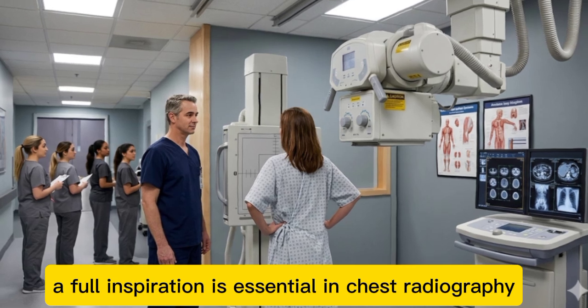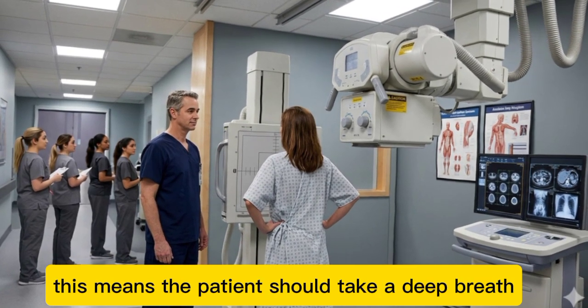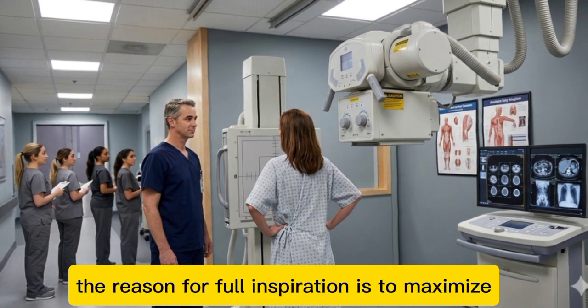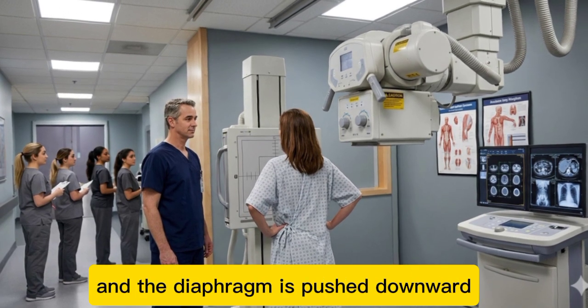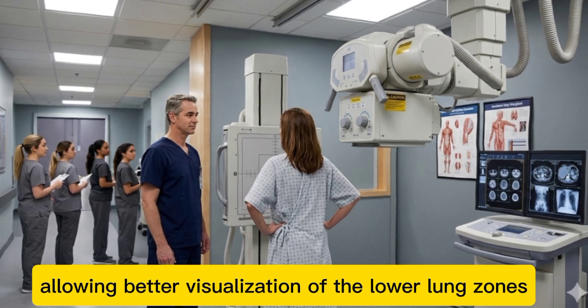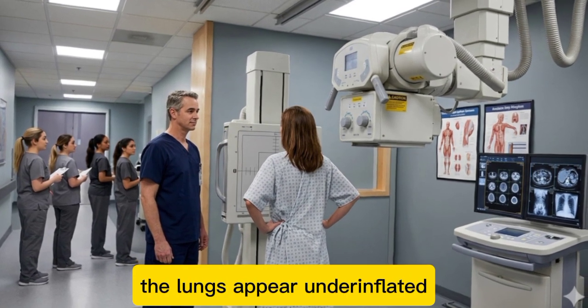A full inspiration is essential in chest radiography. This means the patient should take a deep breath and hold it before exposure. The reason for full inspiration is to maximize lung expansion. When the lungs are fully expanded, more lung tissue is visible, and the diaphragm is pushed downward, allowing better visualization of the lower lung zones. If inspiration is inadequate, the lungs appear underinflated.